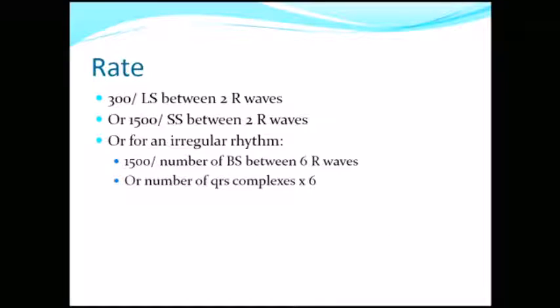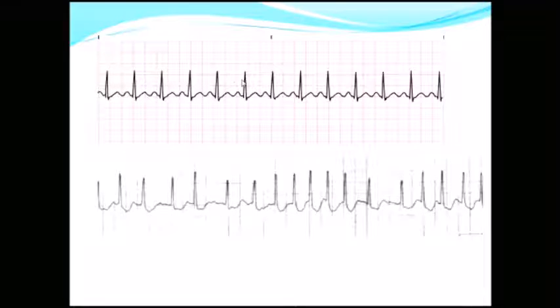Okay. So has everyone seen these formulas before? Okay. Put your hand up if I'm going too fast at any point in time. I just want to skip over the easier stuff before we move on. Okay. So the rate, okay, Tiff, do you want to tell me the rate of this first one? So, what is that? So, about 150, okay?